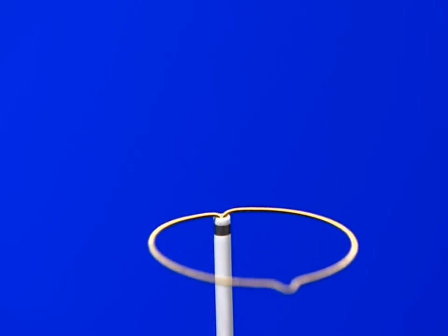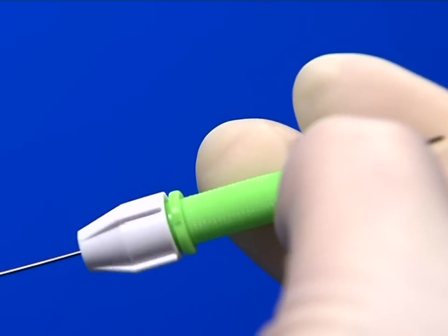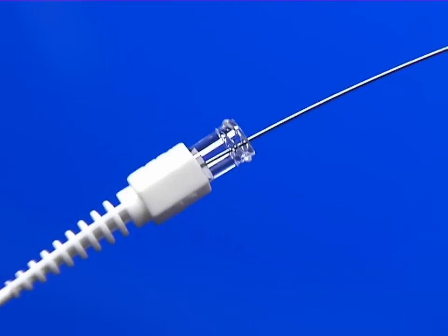The One Snare Endovascular Snare System includes the snare, the snare catheter, an easy-to-grip torque device, and a new peel-away introducer tool designed to simplify catheter insertion as well as deployment.